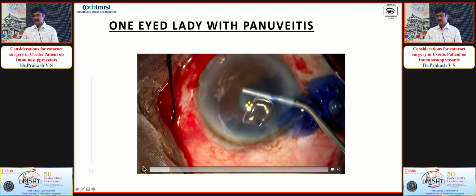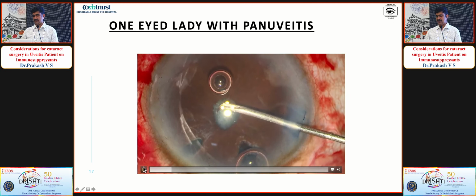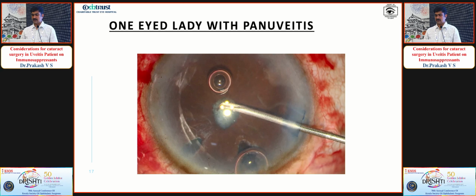And you can see that this lady has undergone a trab before, and we have done a clear corneal section, avoiding the bleb.